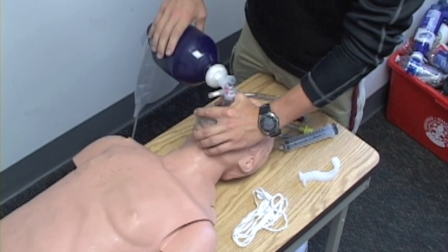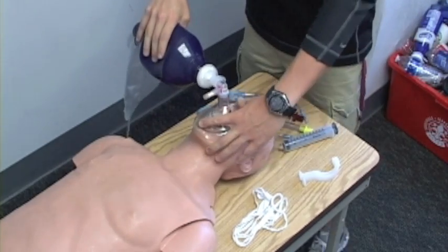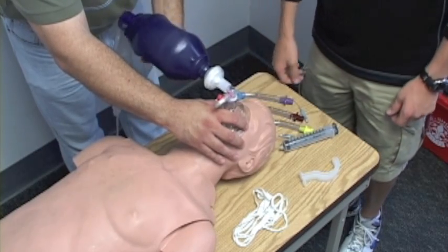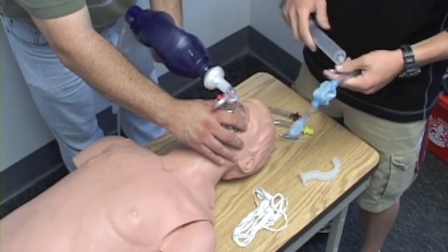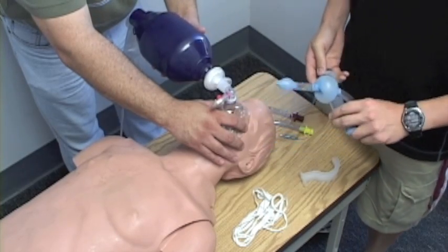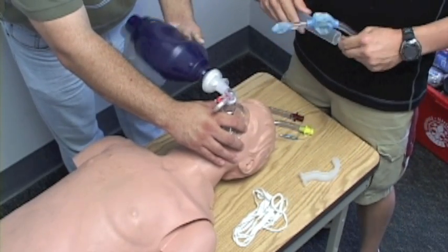I'm going to have my partner continue ventilations for my patient while I prepare my King Airway. I'm going to use a number five for six foot and taller — the properly sized airway for this dummy. First, I'm just going to test the airway, looking for any problems with the inflate holes. Then I'm going to go ahead and lubricate my airway, and have my partner hyperventilate my patient, please.